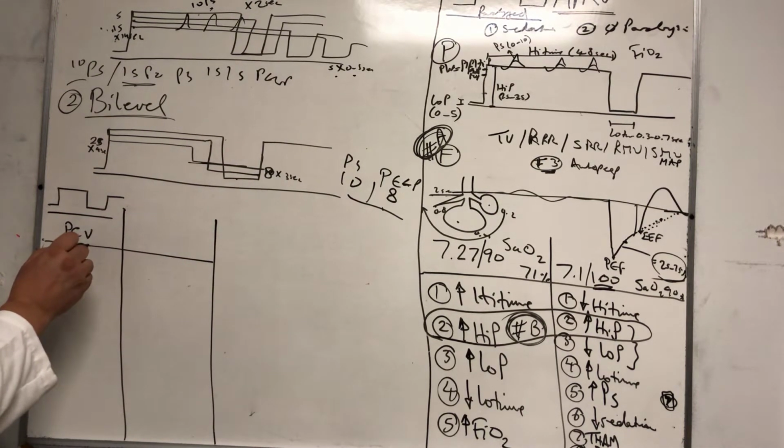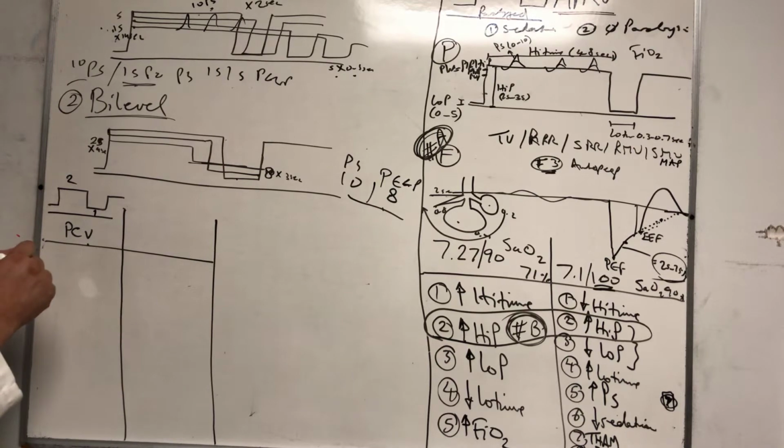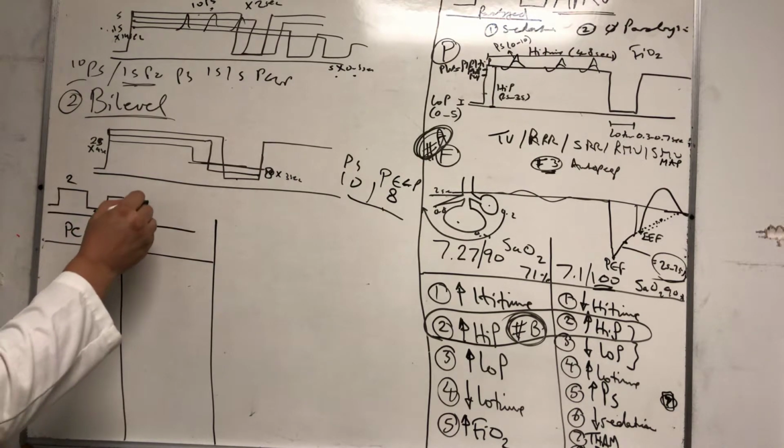But anyway, with the pressure control, let's say a 2 to 1 I:E ratio, this patient is paralyzed now, right? I want to switch him to something that will get rid of the paralytic but give me the exact same wave. Nothing else, exactly the same wave, like this.